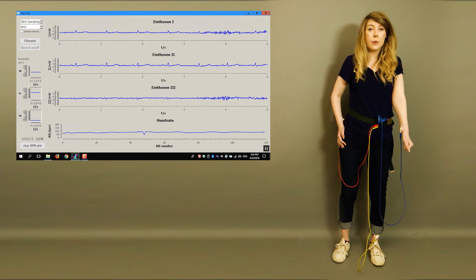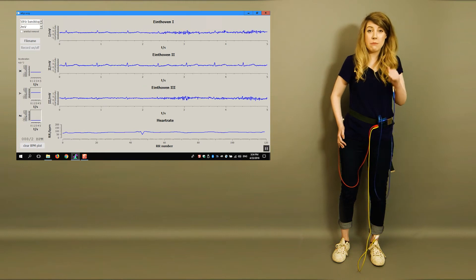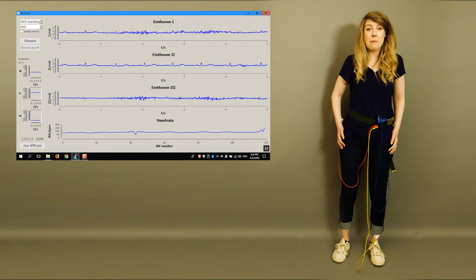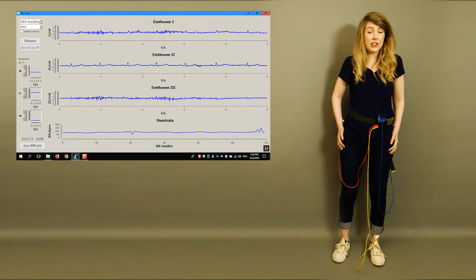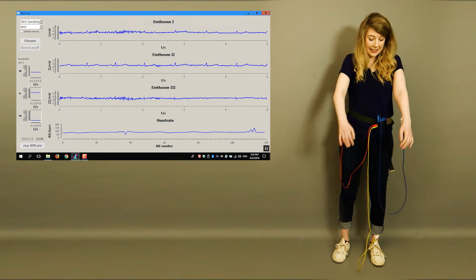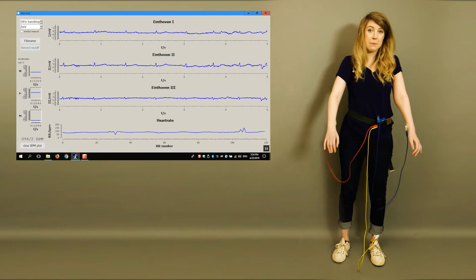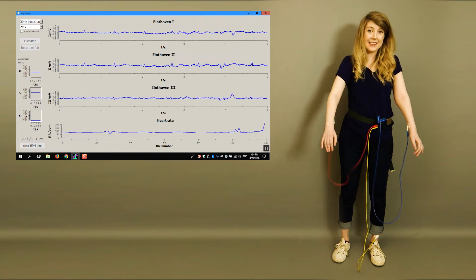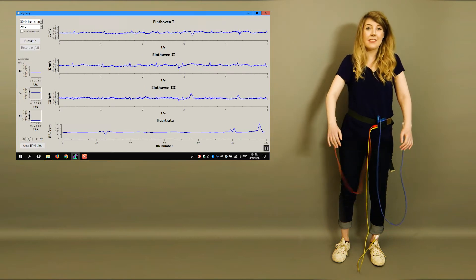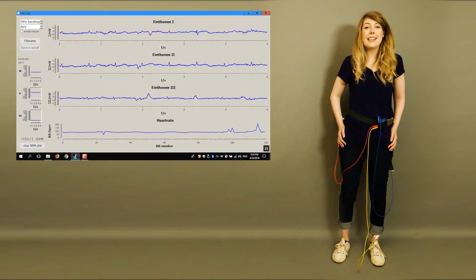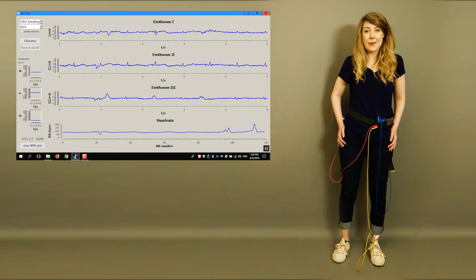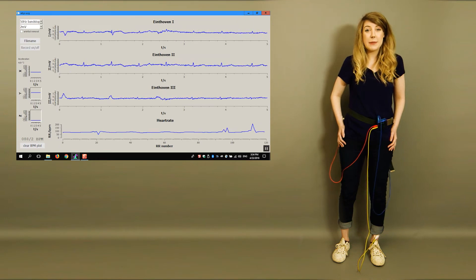Here, we have my EMG contaminating the ECG. And here, the cables cause baseline shifts. Let's fix this now in two steps.